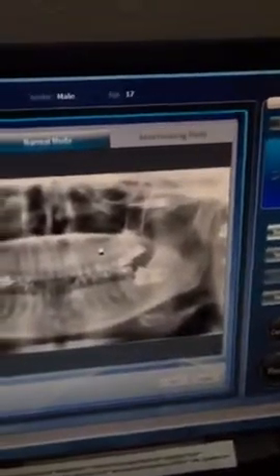That's so far just the preview image. Do you like it? I see the smile. Wisdom tooth. Look at the wisdom teeth. This is the preview of it.